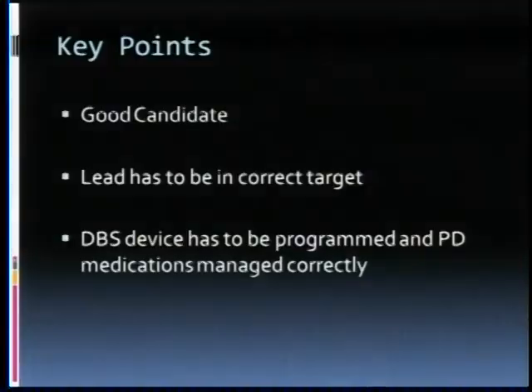But again, at the end of the day, we've got to get that lead in the right spot and pick a good candidate to get a good outcome with this surgery. And those are the most important criteria. I think I've drilled this into you time and time again, so I won't go over that again. And that's it. That's my portion, just going over the differences.